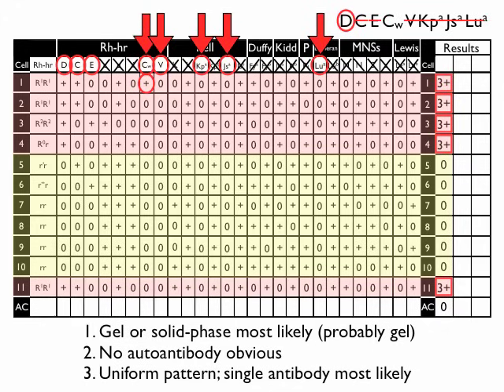CW again is kind of on the borderline. I think about it, but I think less about it than I do many of the other major antibody specificities. So in this case, I think what we can say is, based on everything that we've seen so far, this looks like an anti-D, and we can make a preliminary identification of a single anti-D that explains all the reactions. We're not done in the real world, but in the exam world, that's certainly a reasonable conclusion to make.